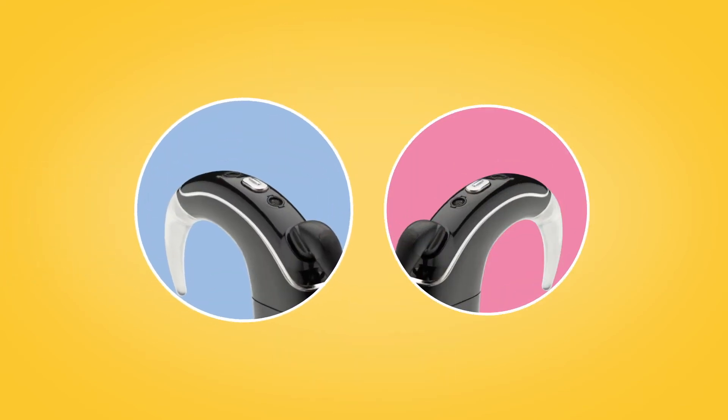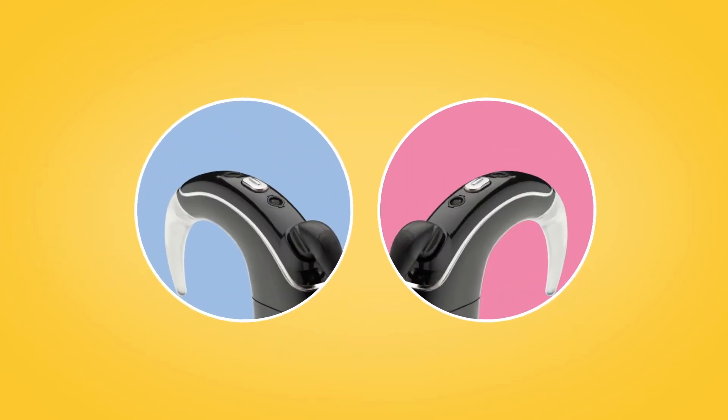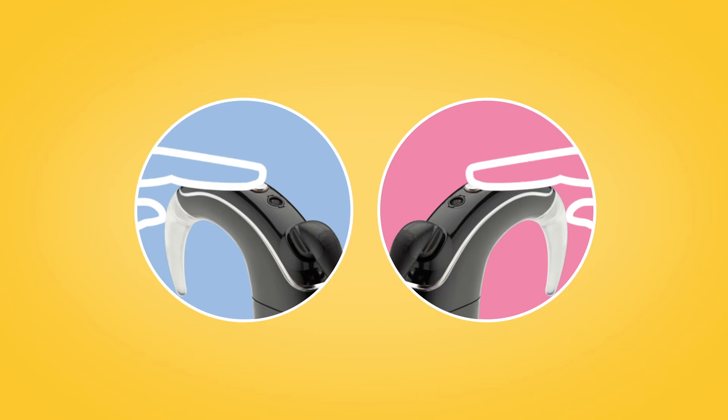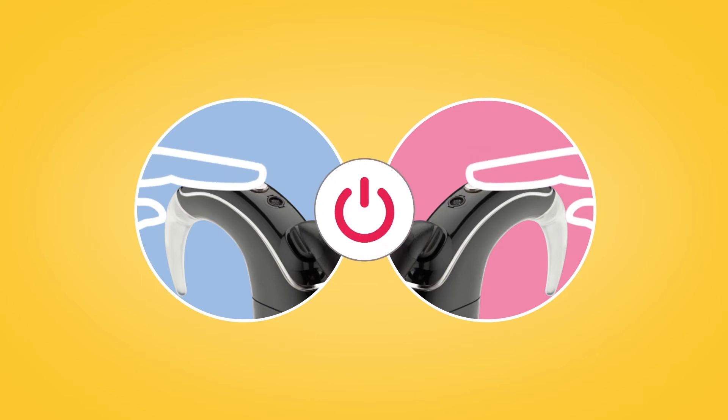If you have two sound processors, both need to be paired during the same pairing window. To do this, turn each of your sound processors off and back on again.